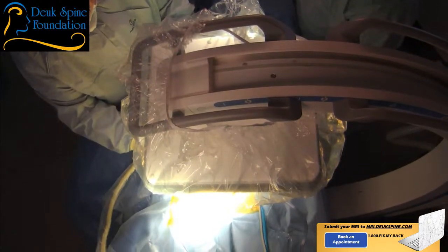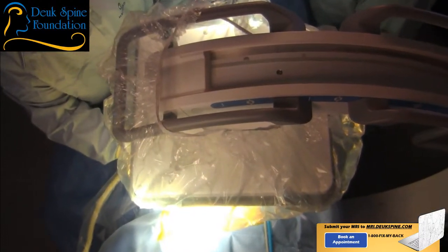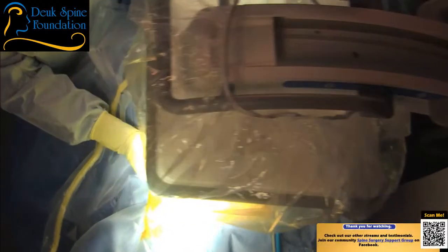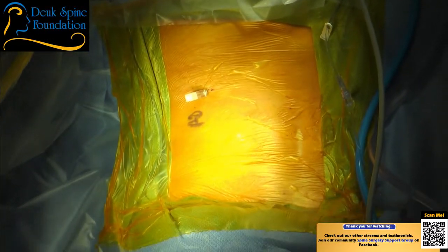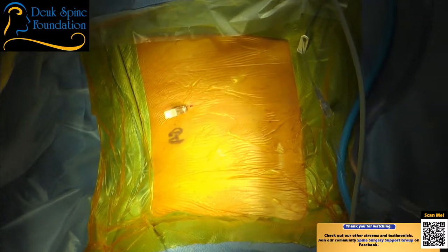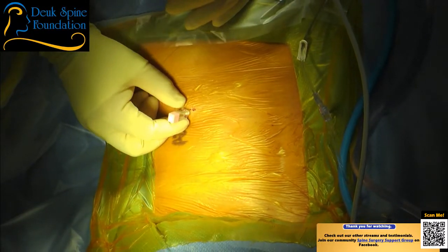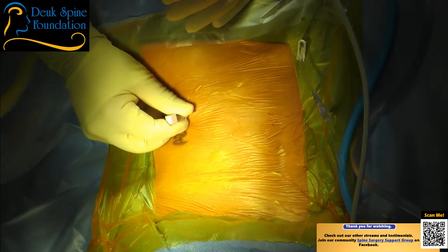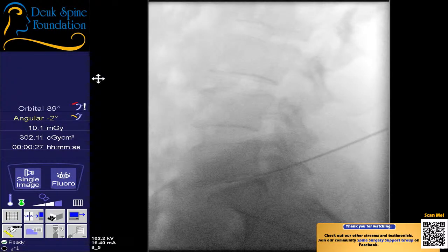Just the back. Go ahead and give me a lateral view. You're doing great. Wait, shot. You're fine, everything's okay. Give me a shot that I can use. Good. Incision. Shot. Shot. Good. Nice job. I want to bring it out just the tiniest bit. Shot. Still in good position.